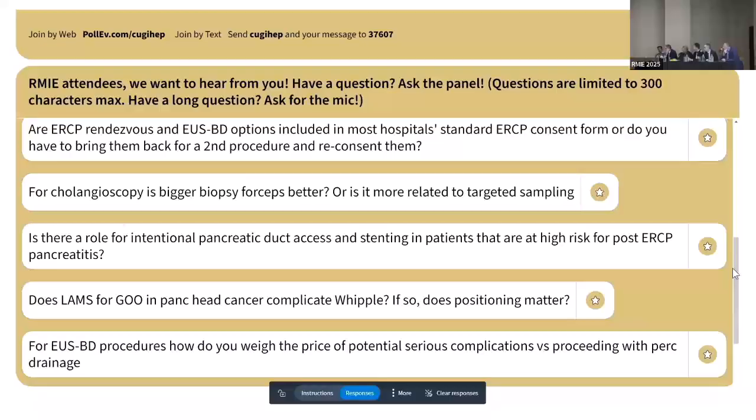Coming to your second point, I'd love to hear from the rest of them, but the data, in my opinion, supports, if you look at the pancreatitis risk, it's after two cannulations of the pancreatic duct. If you haven't caused enough trauma by just cannulating with a guide wire the pancreatic duct once, in my opinion, it depends really if I've gone past the genu or not as well. But if I haven't gone past, because hopefully you recognize it quite early, unlike my case yesterday, that you've cannulated the pancreatic duct, you do not increase the risk of pancreatitis by having a second attempt. So you do not have to remove it.